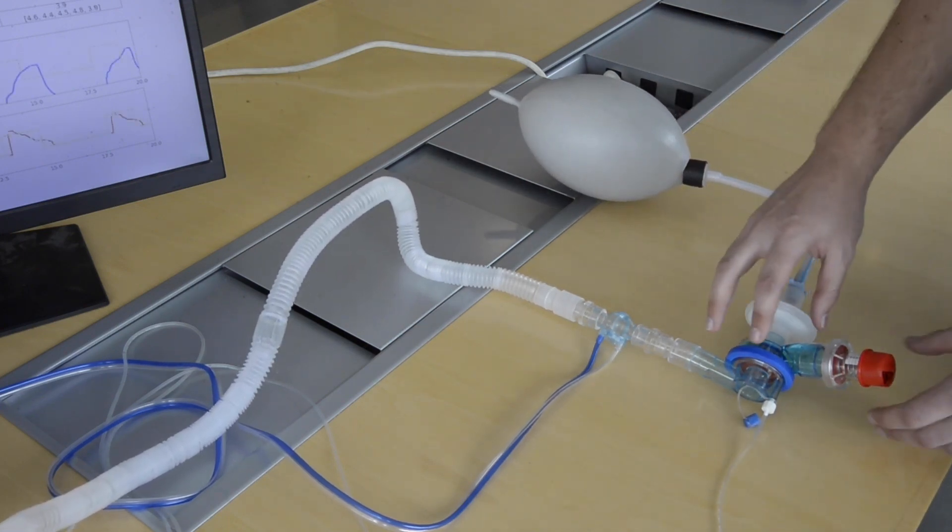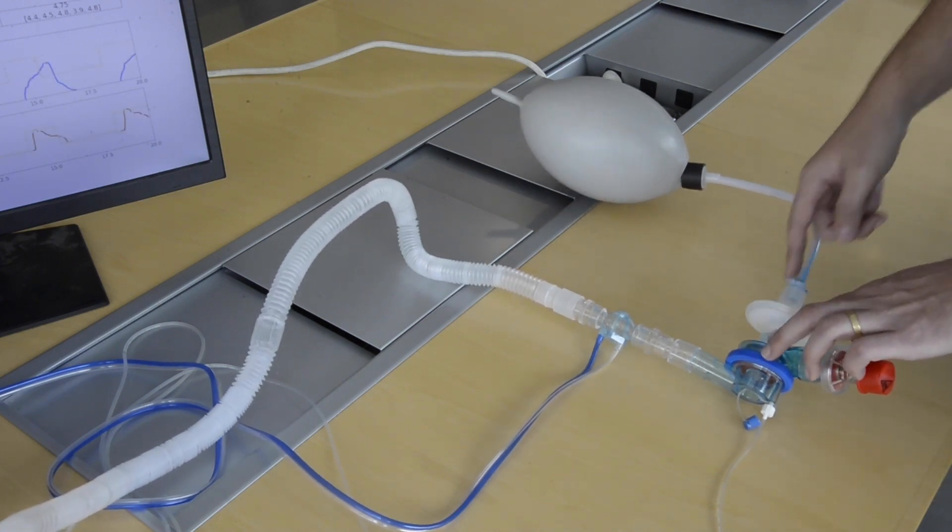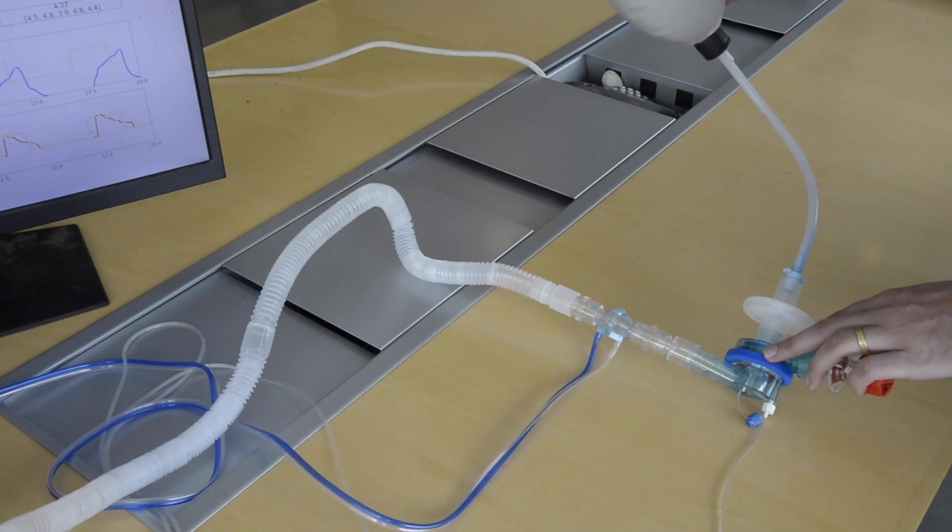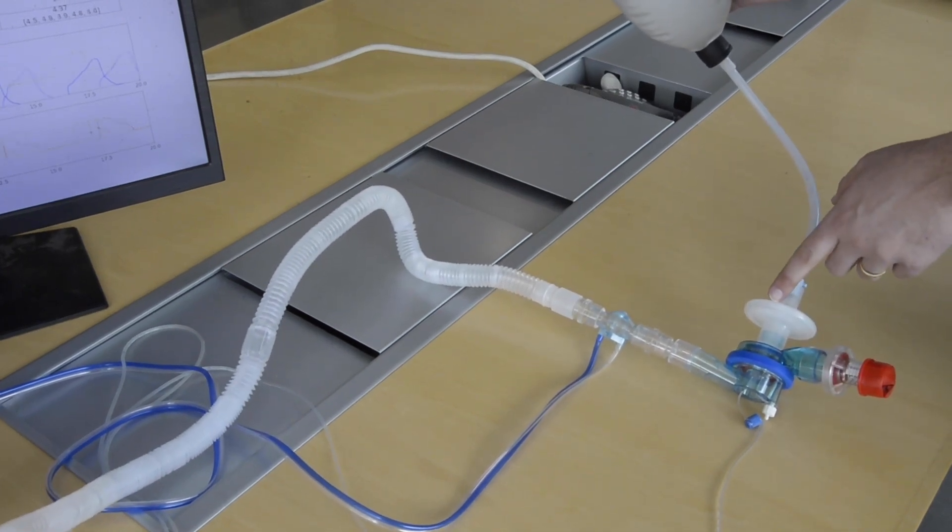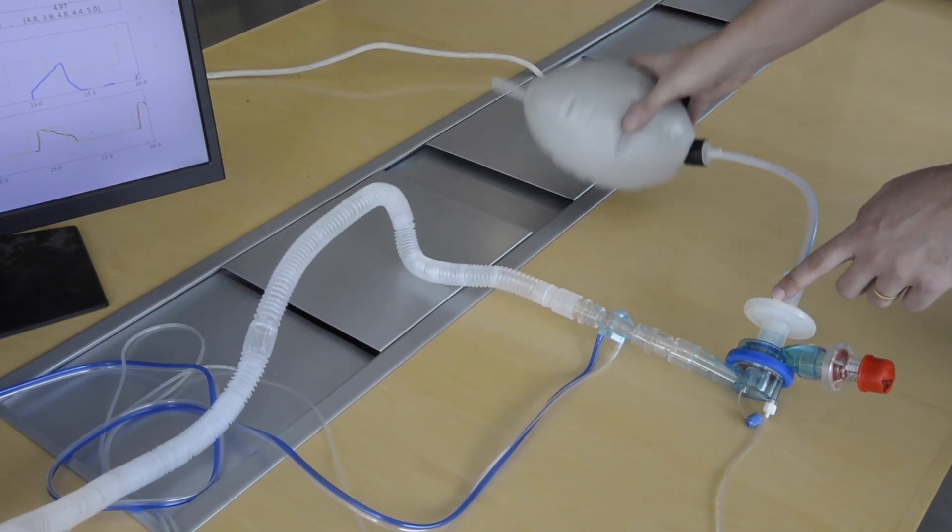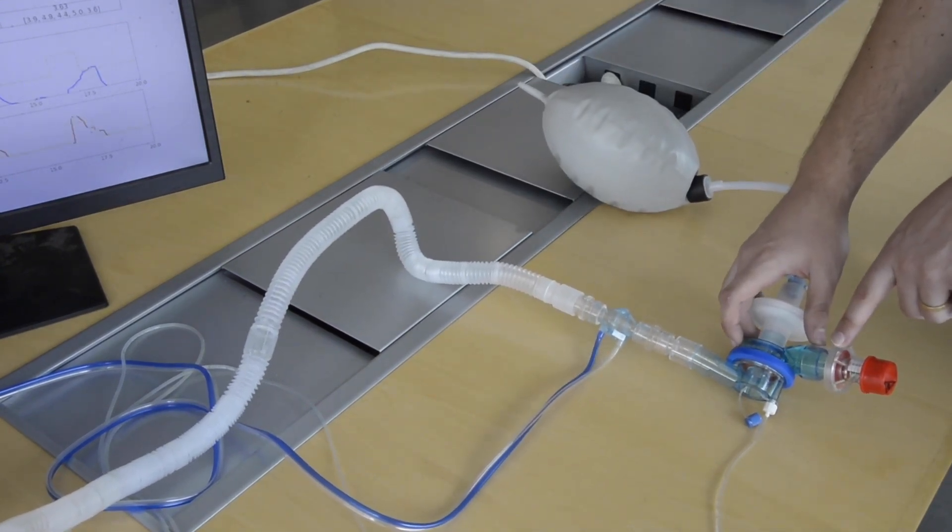This also feeds into a non-rebreathing T-junction which has one direction going to the patient where we have an artificial lung separated by a bacterial viral filter, and then on the expiratory limb is a common PEEP valve.